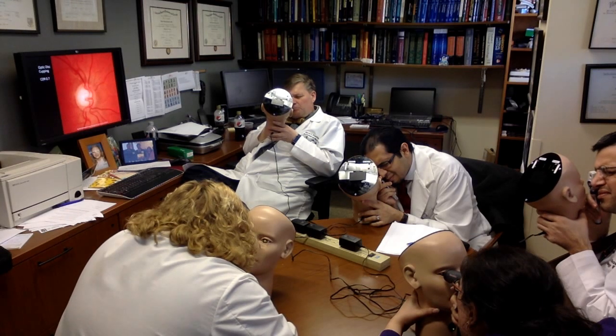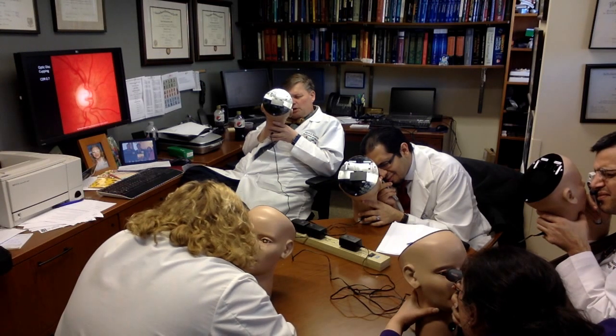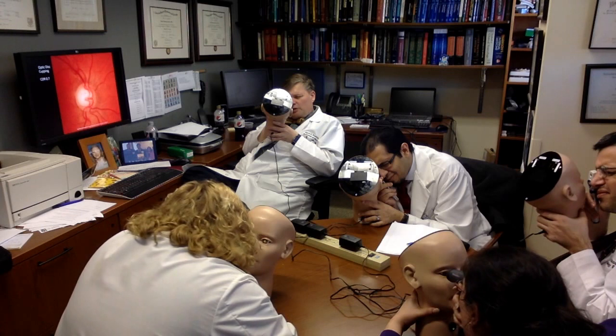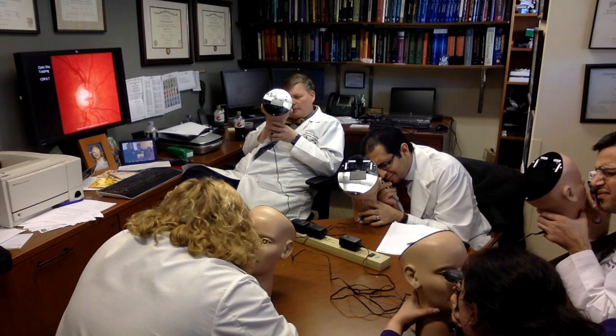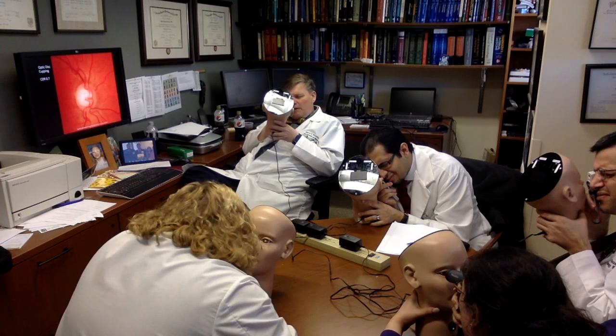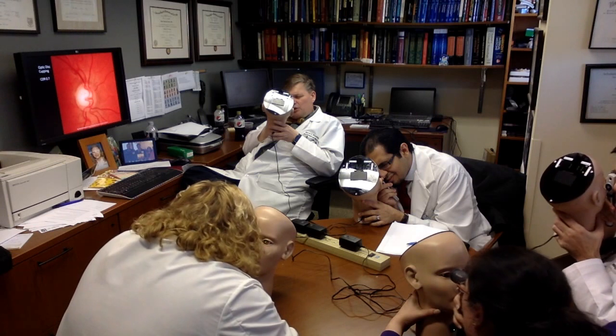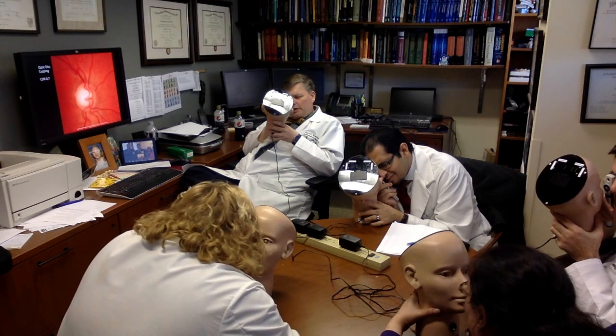Now, let's look at the borders of the disc. What do you think of the borders? Are they distinct? Totally blurred. They're blurred on the left, blurred on the right, blurred up, and blurred down. So this is papilledema, okay? However, one of the most important things about papilledema is that the optic nerve head is elevated or raised.